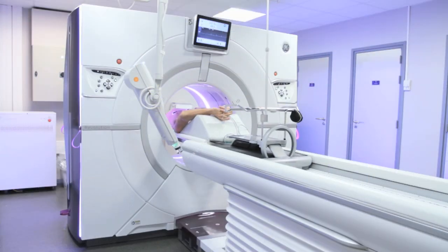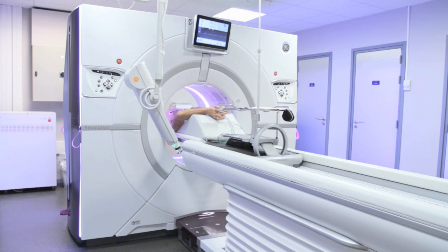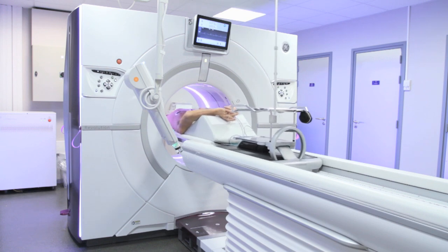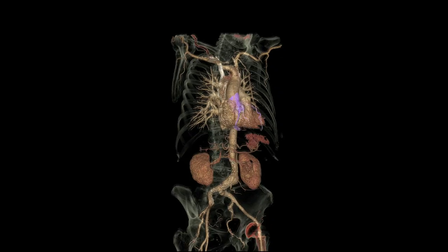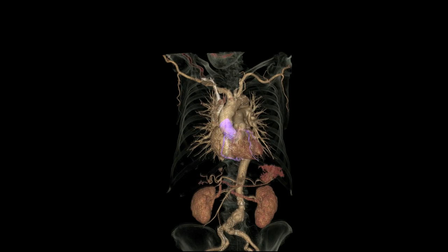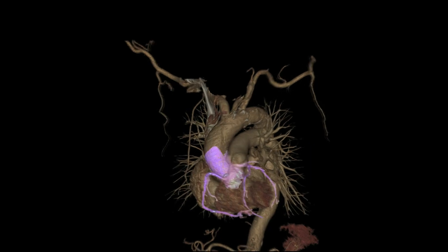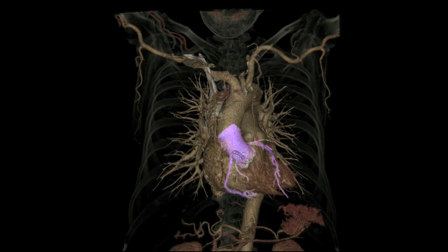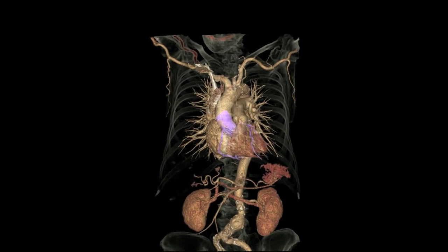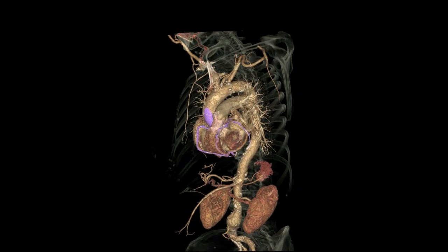One of the keys is that Revolution CT allows you to quickly switch between multi-volume gated axial and fast non-gated helical scans seamlessly. You can generate excellent image quality for both the coronary arteries and the entire aorta at low dose, without having to ask the patient to hold their breath for an extended time.